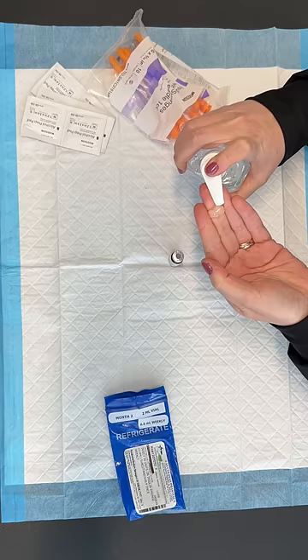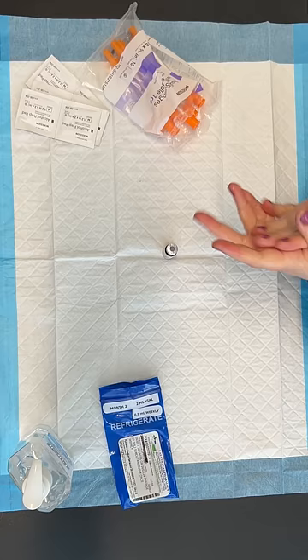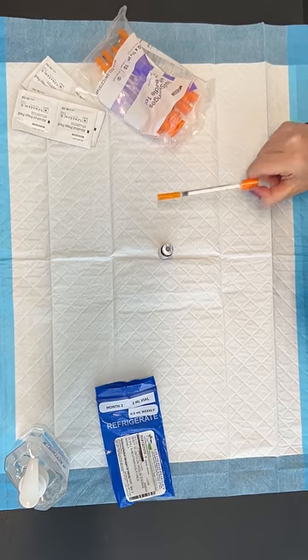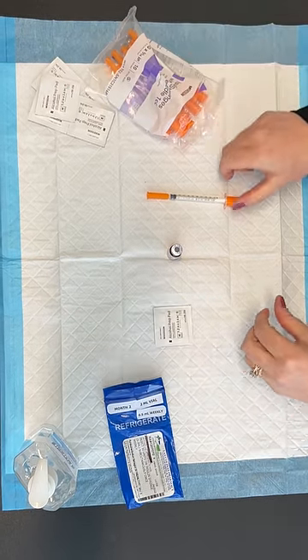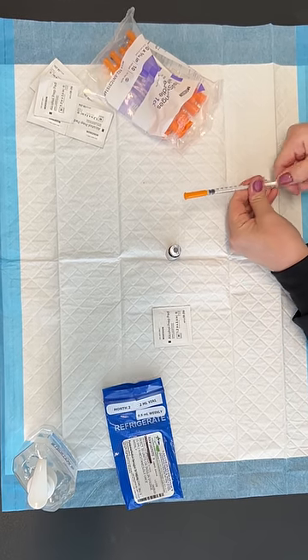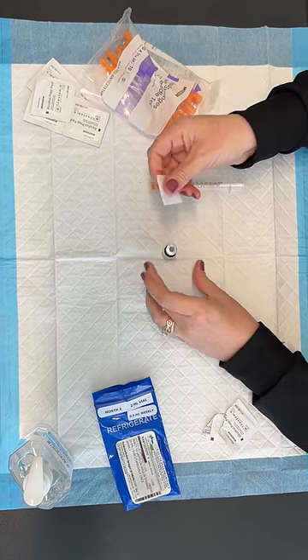Go ahead and sanitize your hands with hand sanitizer or wash your hands thoroughly. Now we want to make sure we use an insulin syringe for this — it already has the needle on it. We don't want to do any switching of needles. You can remove the cap at the bottom of the syringe. Get your alcohol pad and you're going to swab the port to make sure all of that is clean.